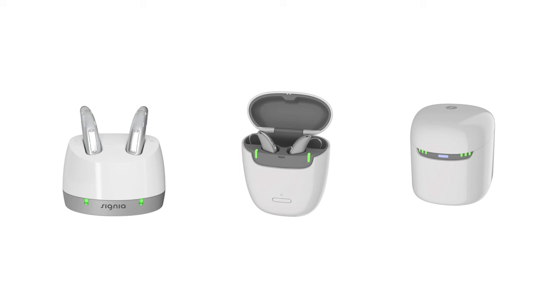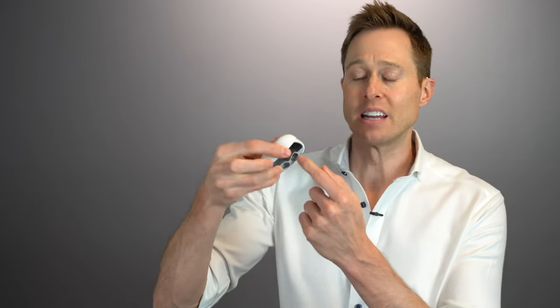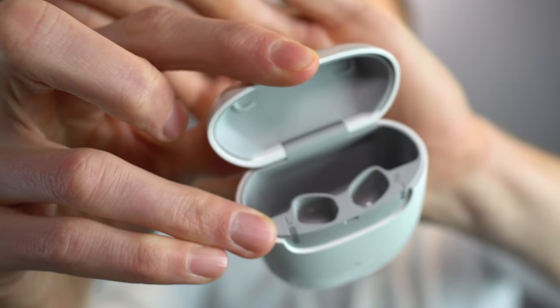The rechargeability is essentially the same as the previous generation. You have three different charger options: the standard charger, the portable charger, and the dry and clean charger. They all still use galvanic charging — you have charging contacts inside the little wells, and it magnetizes and pulls your hearing aid into place. It's very easy to put in and pull out, though I do wish the well were bigger, especially if you need to use a custom ear mold on the tip.